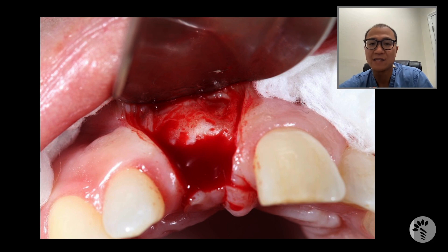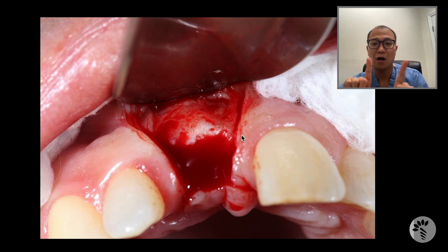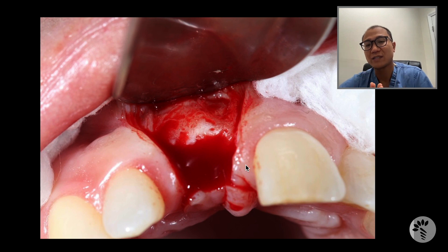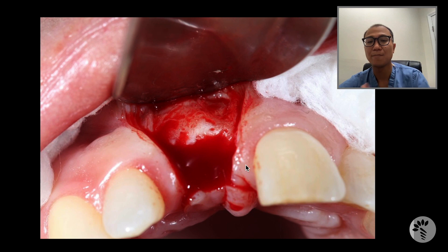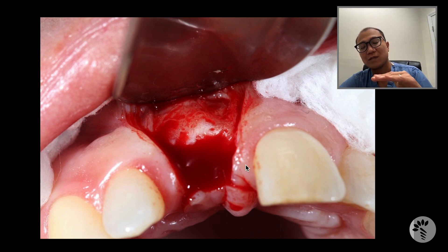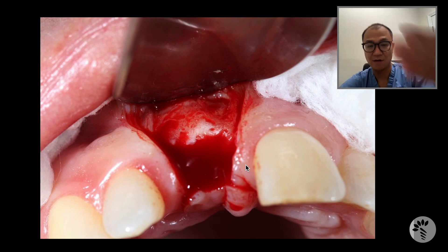This is how my incision looks. I dropped two vertical incisions and a crestal incision, and the vertical incisions are away from the adjacent teeth, leaving at least two to three millimeters of gingiva there. This is what we call a papilla preservation incision. By dropping two verticals, I can clearly see the apical portion of the alveolus by reflecting the flap.